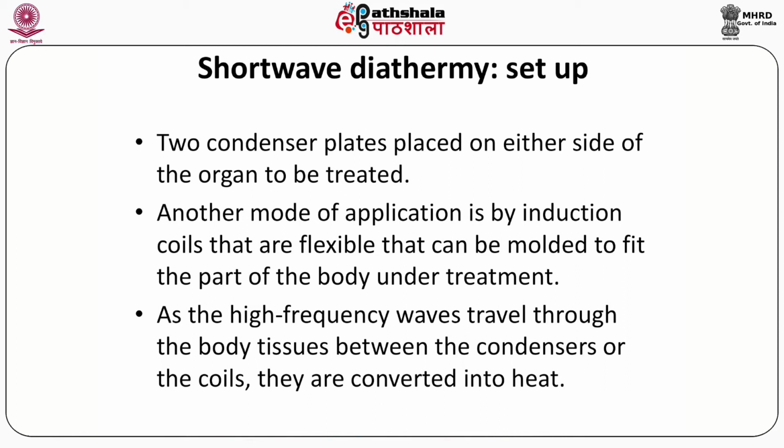Either we should use the two condenser plates or molded induction coils. As the high frequency waves travel through the body tissues between the condensers or the molded coils, they are converted into heat. So currents travel from one condenser plate to another condenser plate through the tissues, and while traveling through the tissues, the high frequency waves are converted to heat.